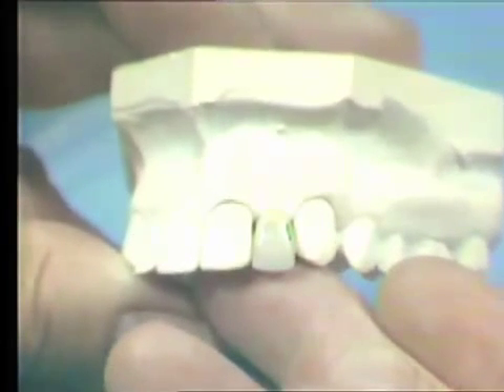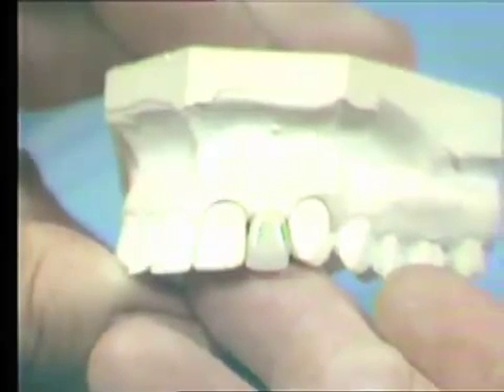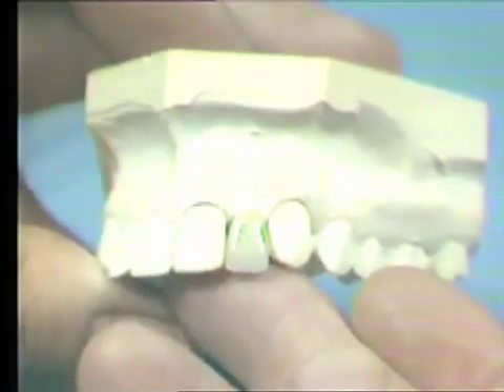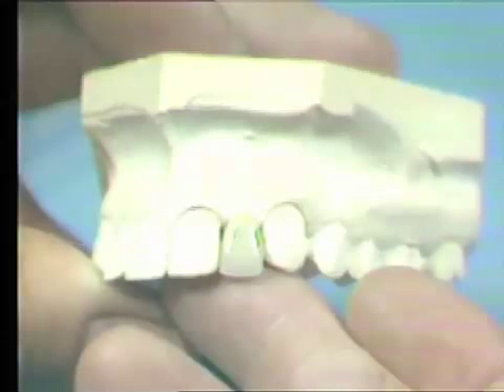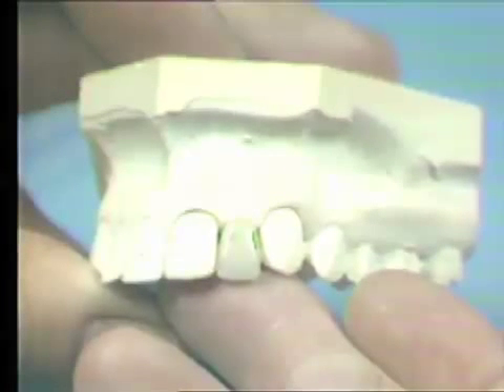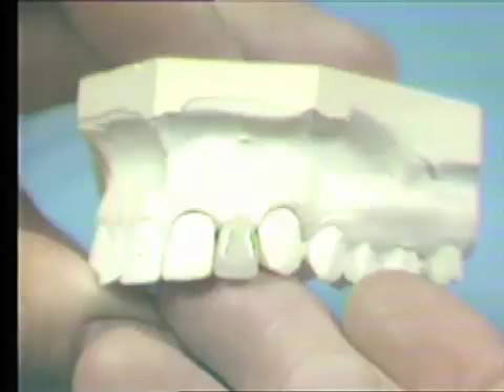We see that the pre-made pontic is wide mesially-distally and must be narrowed to fit the edentulous space. Also, it is long cervically-incisally. After making these corrections, develop the mesial and distal concavities and the surface contours using the stones in the porcelain polishing kit.